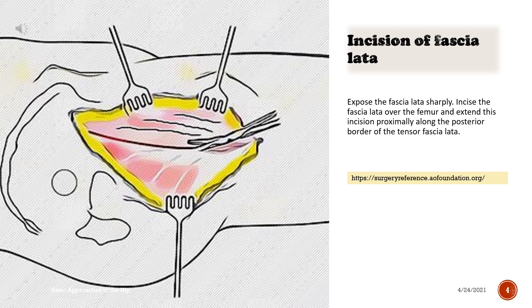Incision of fascia lata. Expose the fascia lata sharply. Incise the fascia lata over the femur and extend this incision proximally along the posterior border of the tensor fasciae latae.